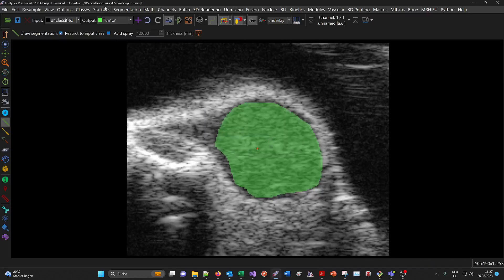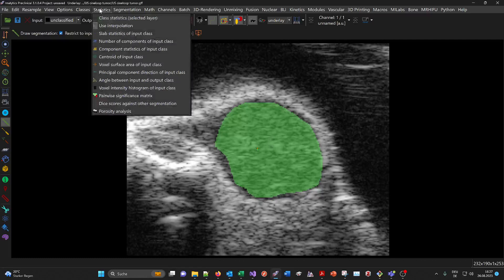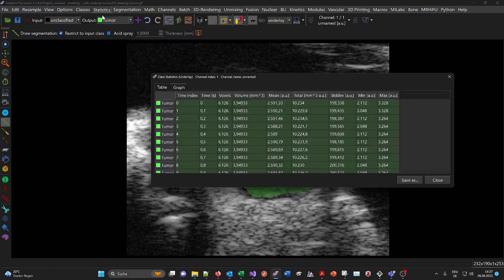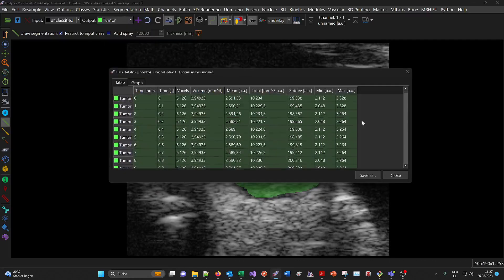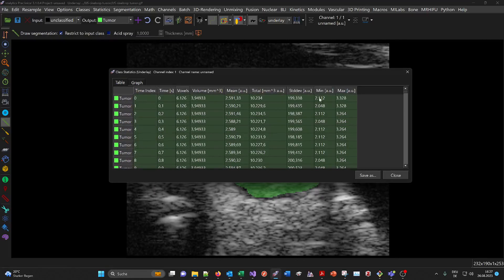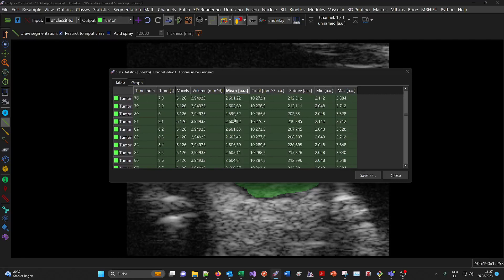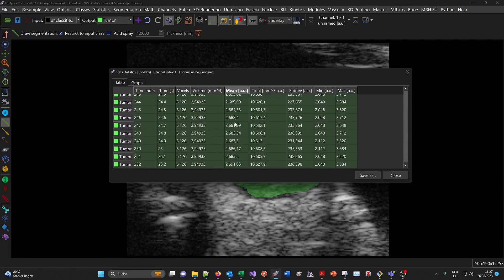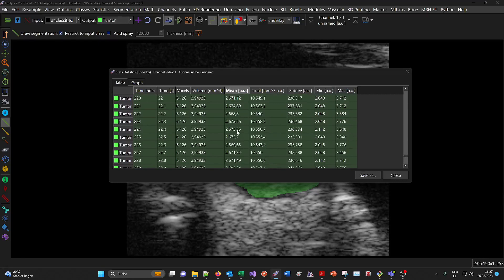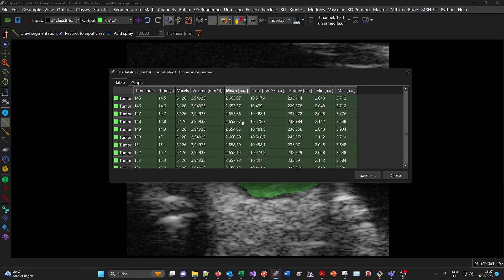You can use the statistics menu to get the class statistics. You get one row per time point of the tumor region, and this is the mean intensity. If you scroll down, you'll see that it increases eventually due to the inflowing microbubbles.